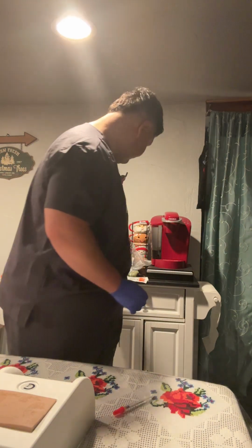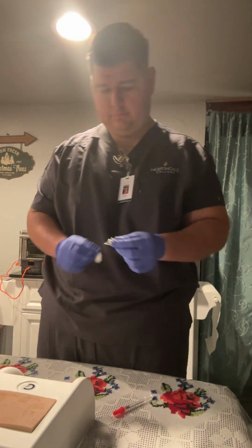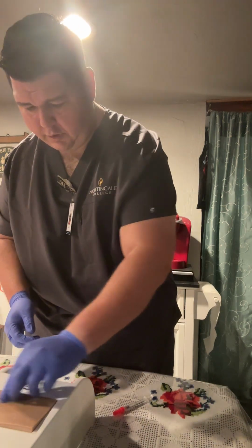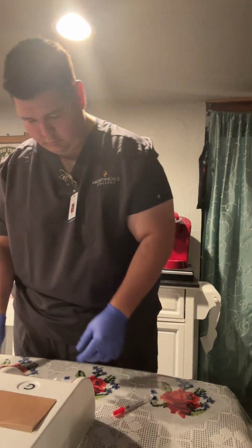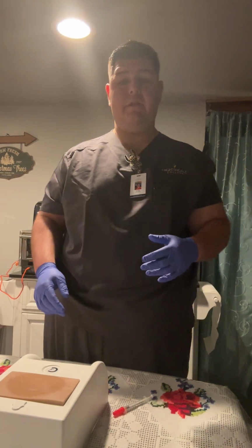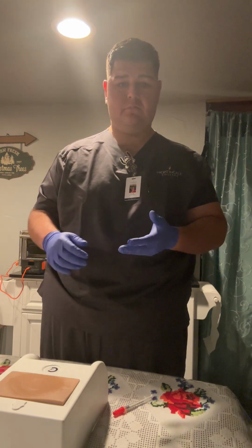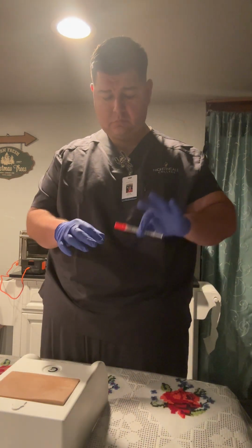Get my alcohol pad. So start at the center and clean out in a circular motion, 2 inches out. Now letting that dry, I have cleaned it. While I'm letting it dry, since I have cleaned this, I don't want to touch it. And I want to point out that when injecting, I want to use the thumb and the index finger, like this, to hold my syringe so I can remove the cap safely.